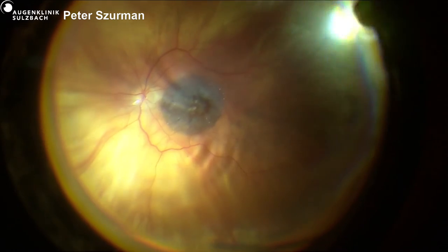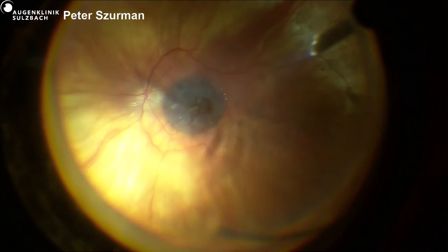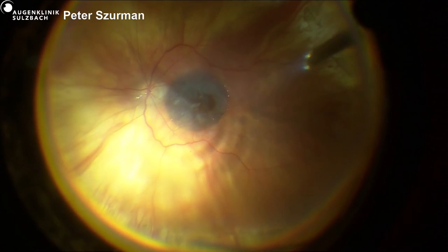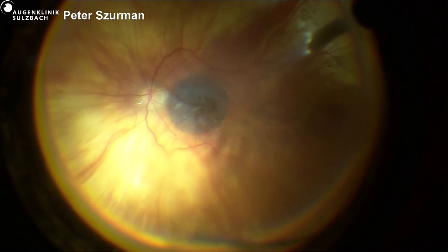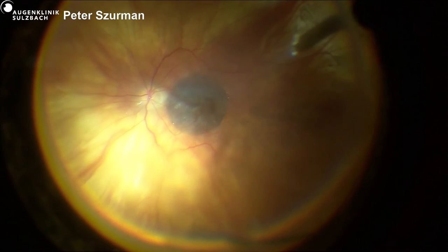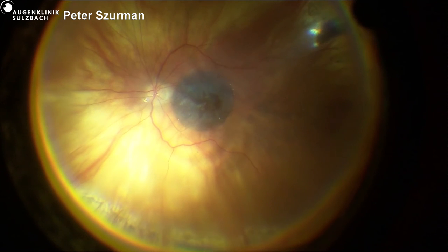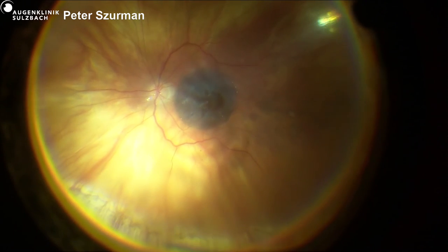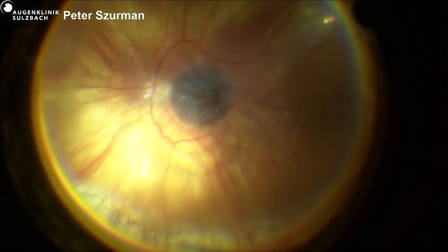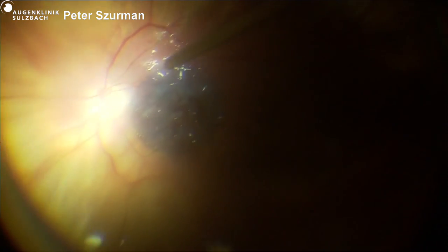You haven't missed anything because I've shown the spreading and silicone oil filling in the surgery before, but I want to discuss and show two small minor tricks, which I have learned with about 30 cases of epiretinal amniotic membrane. The first is to assure the right orientation. We use the shark fin mark, which we have published for DMEC surgery, where the same technique is applied. So this is a very small triangular mark, which is done with a scissor. And this shows you if the position is regular or upside down. It's very small. I'm not sure if you can see it now, but it's a triangular mark here.